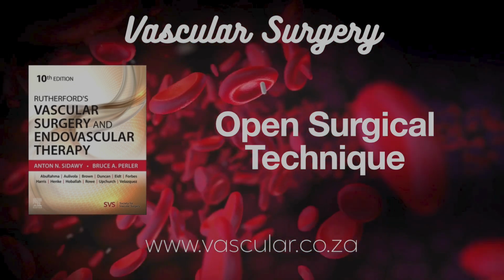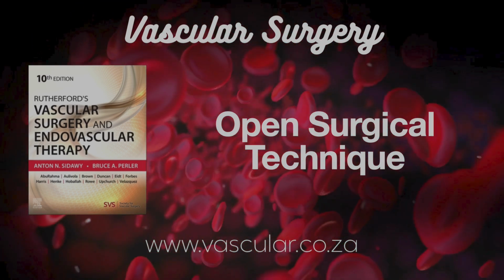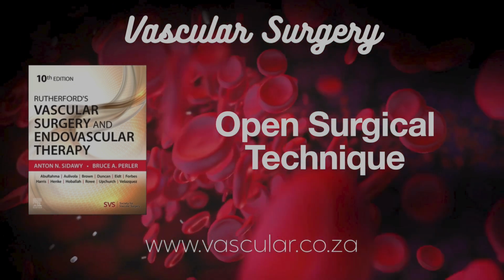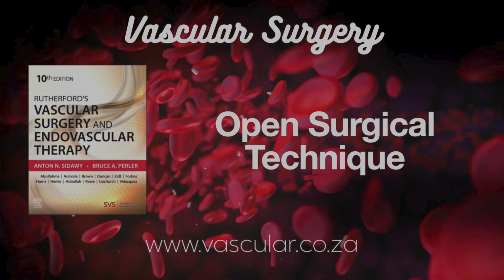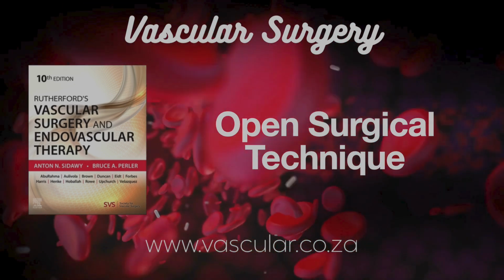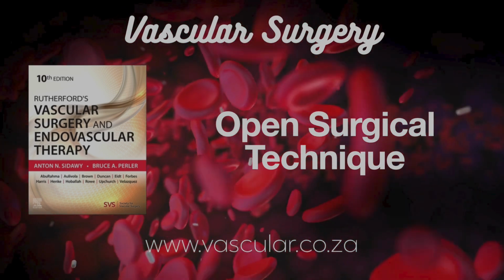Distal vein patch techniques. Interposing vein between graft and artery. Yes, several variations, especially for prosthetic to tibial bypasses. Miller vein cuff: vein opened, sewn to arteriotomy, ends sewn to form an oval cuff, graft sewn to cuff. Can have turbulence issues, tricky and tight spots. Taylor patch. Longer arteriotomy, longer patch, U-shaped slit in the graft underside, graft heel to proximal arteriotomy, anterior graft incised. Vein patch closes the elliptic defect, but exposes native artery intima to the graft proximally.